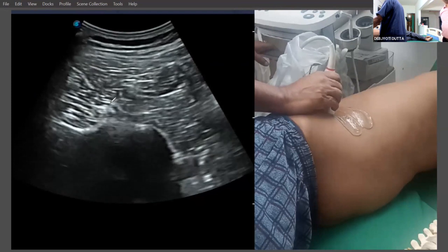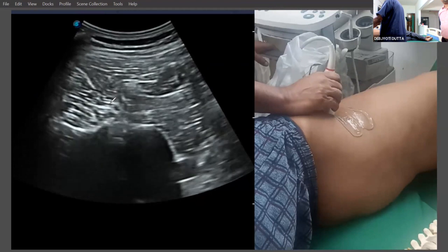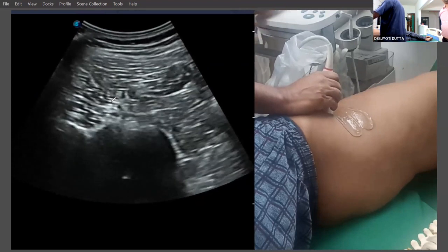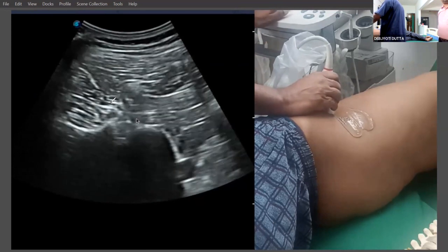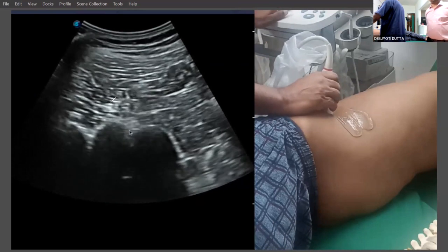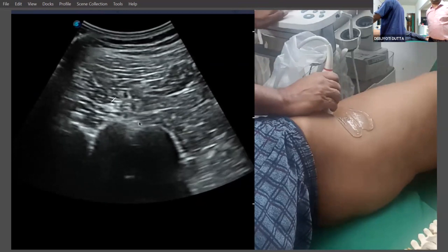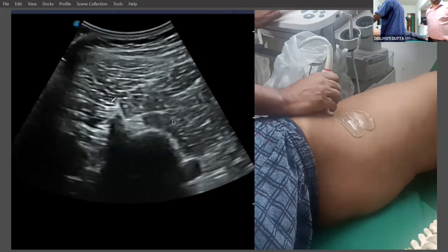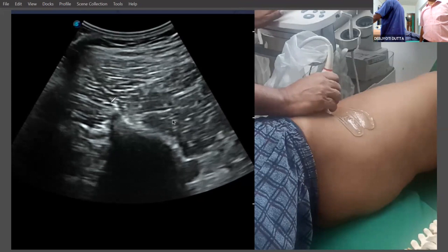So in the foramen, you can see the pulsating vessels, you can see the nerves, and if I am going above and below, you can see the connection. You can see this is the lumbar plexus. If I am moving it, you just follow this. You'll be able to see the nerves from the foramen, see this is the foramen very nicely seen, and you can see the connections there. So now you see how it is forming the lumbar plexus.